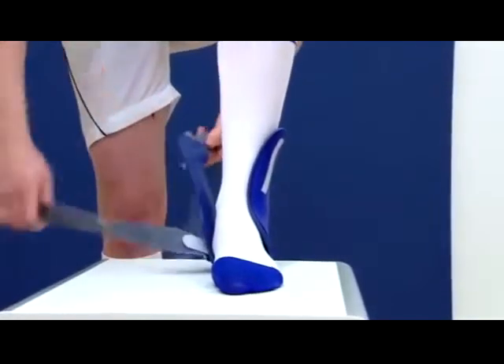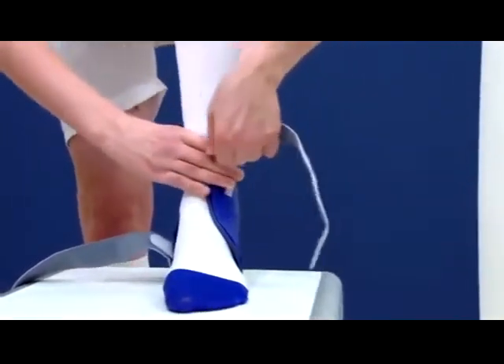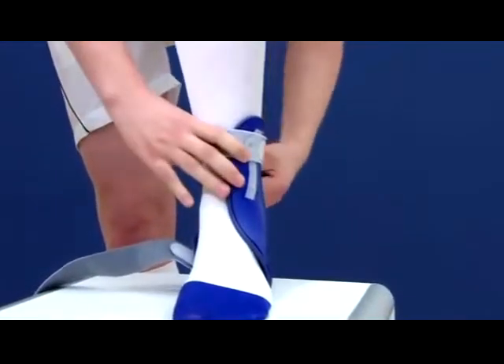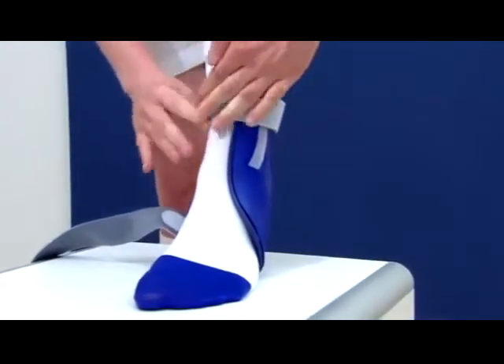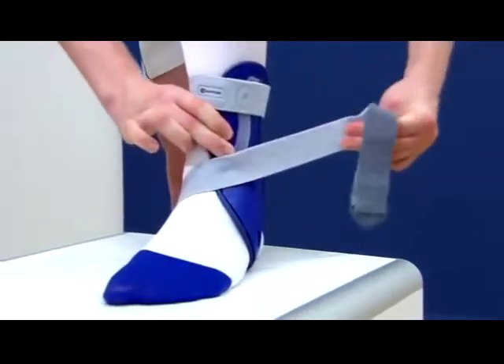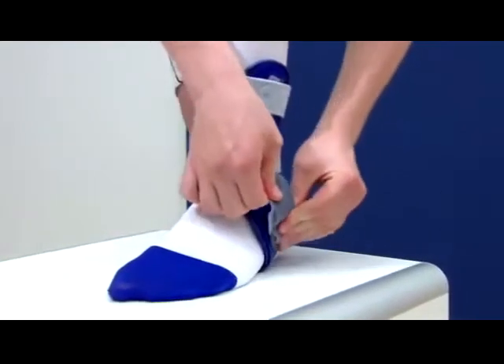In future, the patient can put on and take off the Malleolock properly by themselves. Start with the upper strap following the square symbols, then use the round symbols to guide the lower strap in a figure of eight. Fasten and close the straps.